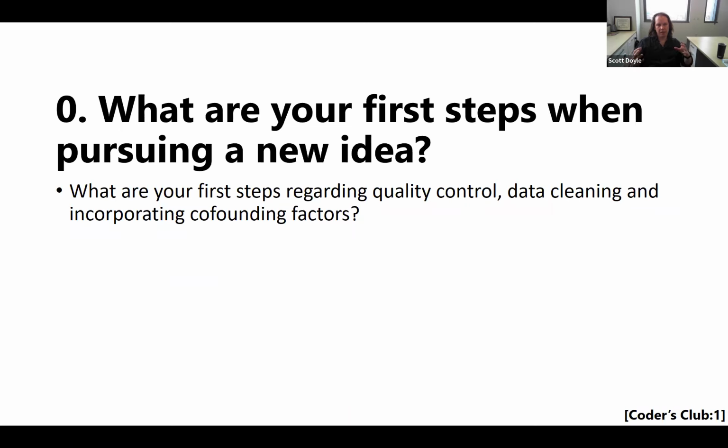And sometimes that works really well, where it will right away get the basic classes out of the way. And then we can start with the pathologists looking at the data and the outputs of the algorithm and say, okay, it seems to struggle with the difference between normal mucosal tissue and neoplasm. And so then we have to go in and train it with more examples for that. So that active learning loop is really important in our initial phases of a project.